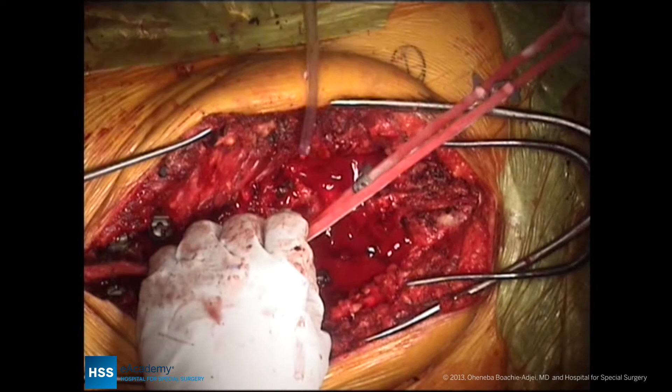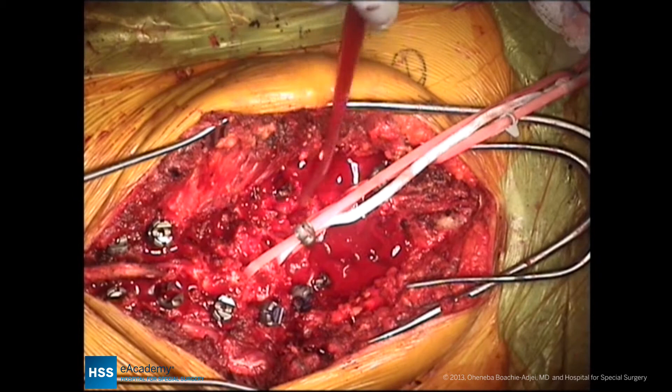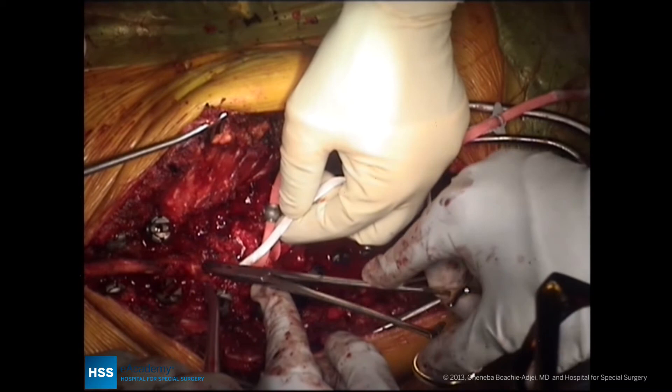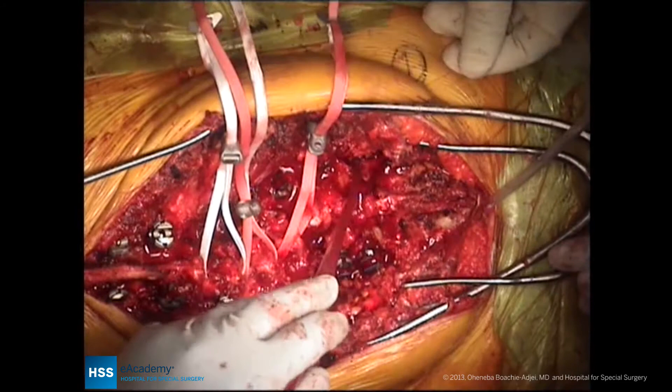We now have two apical universal clamps, which will be attached to the concave rod, which will lie very far out to the right, and then will translate the spine over to the concave rod. Here we're passing a third clamp proximally, so that we have more effective translation of the concavity of the spine to the pre-bent concave rod. Three universal clamps have been attached at the L1, L2, and L3 levels.